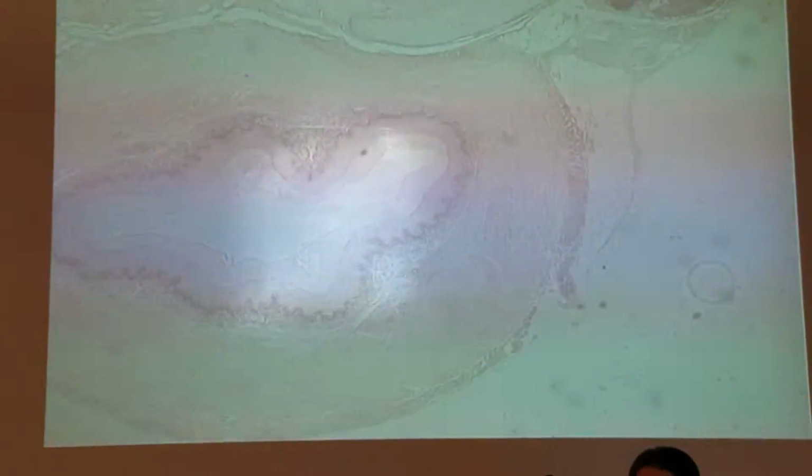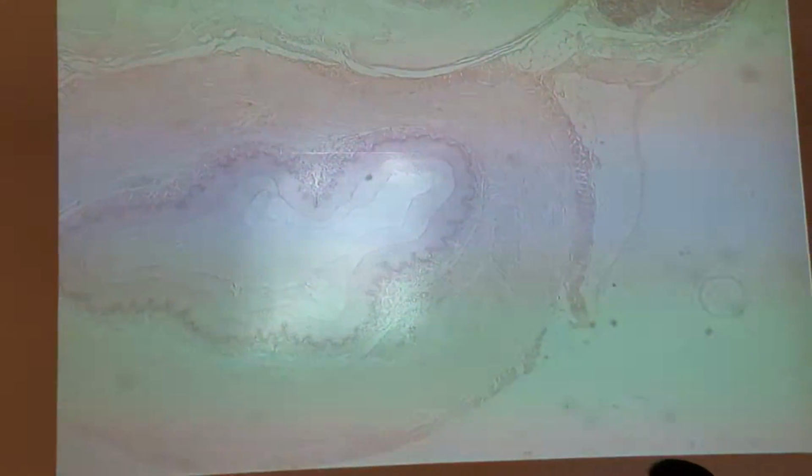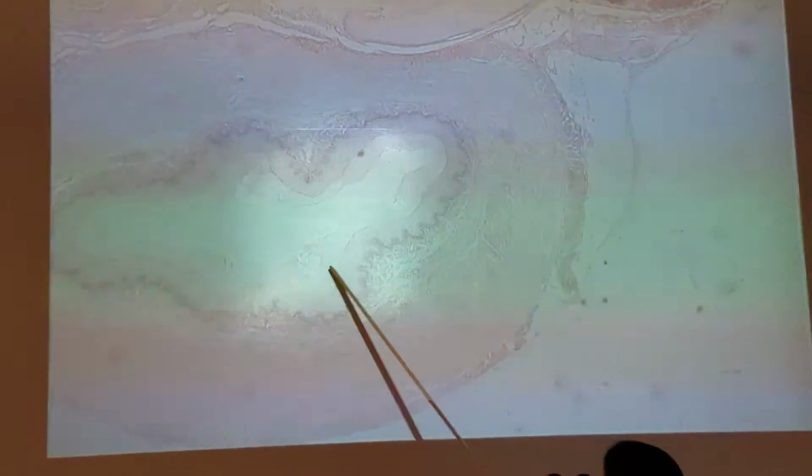But the mucosa layer is going to be the one that lines the lumen. On the hint page, on the esophagus, it says it may have some mucus in the lumen, so ignore it. So this is mucus. This is not a true layer of anything. That's mucus. So that means we start here. So what is this layer?